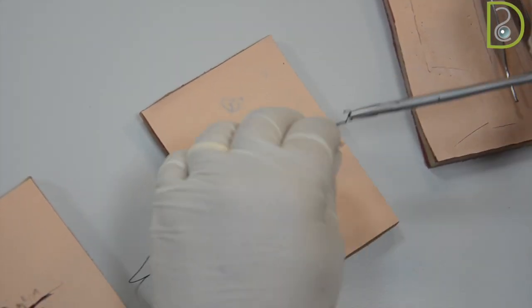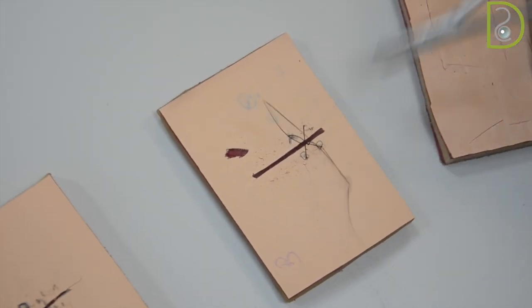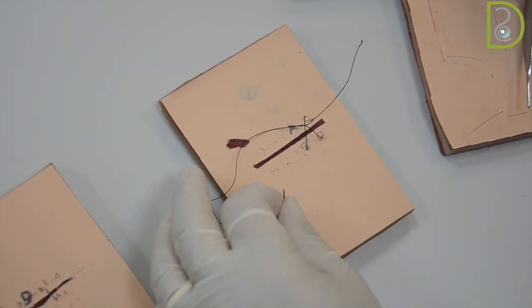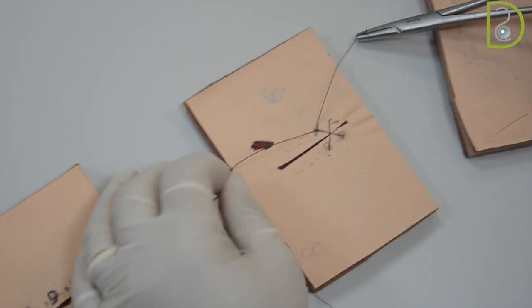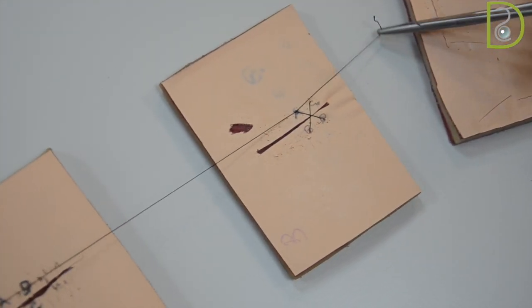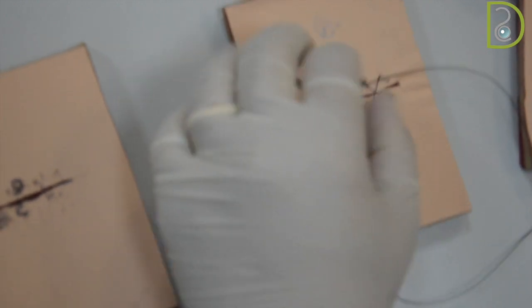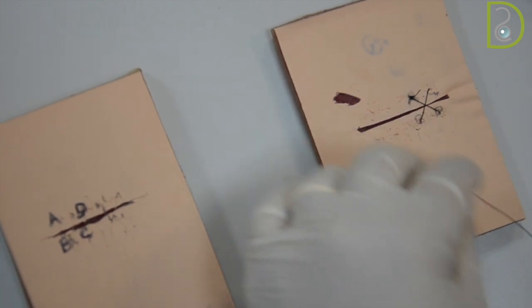Also taking it away. It got tangled — I have to adjust it again. It happens. Let's adjust it again, then anticlockwise. Then you can cut a little bit away from the knot, at least 3mm. That's how you take it.